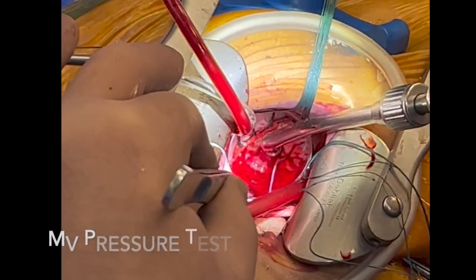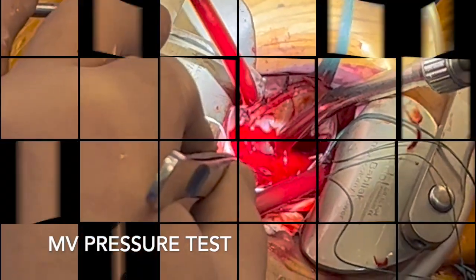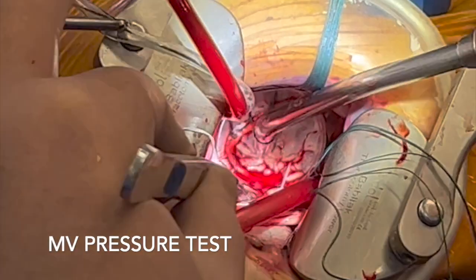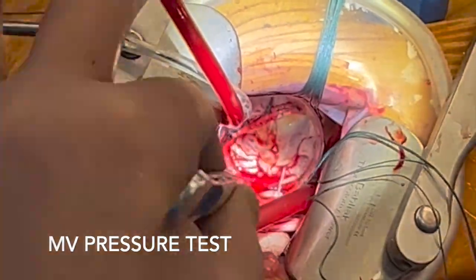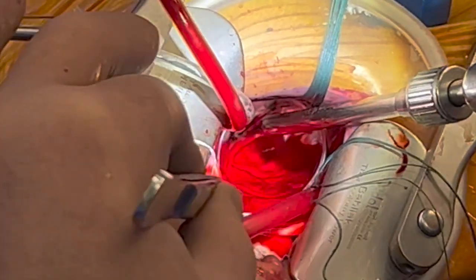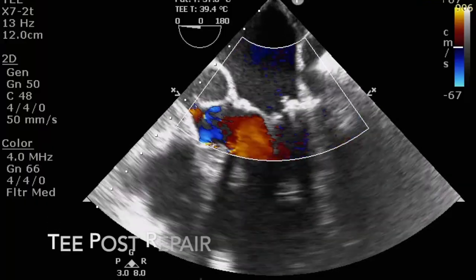As you can see by the pressure test, the result intraoperatively was very good. We usually do this pressure test with blood from the pump. And the post-repair 4-chamber echo was also good.